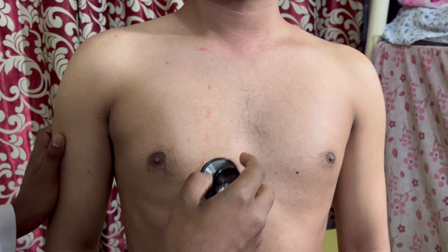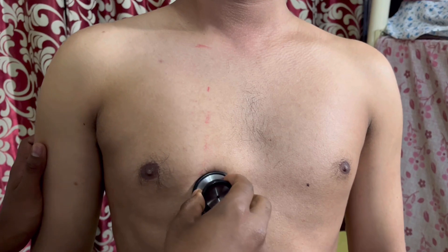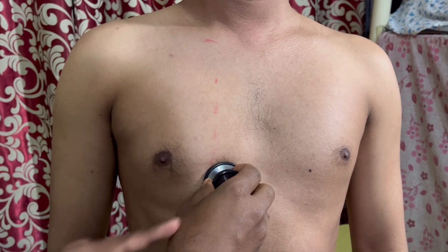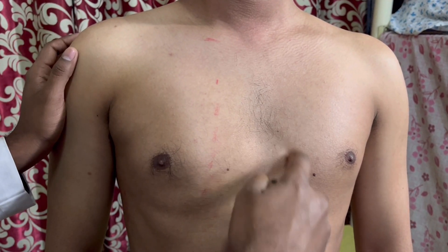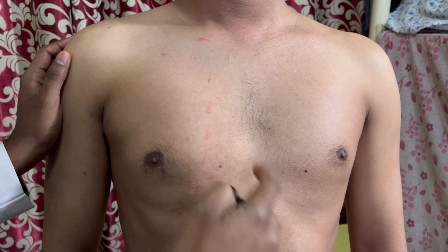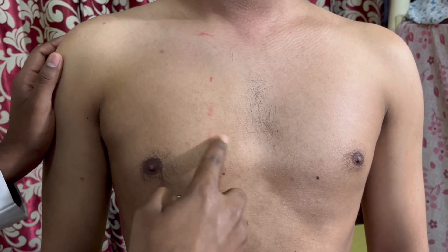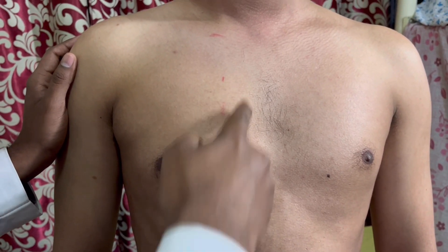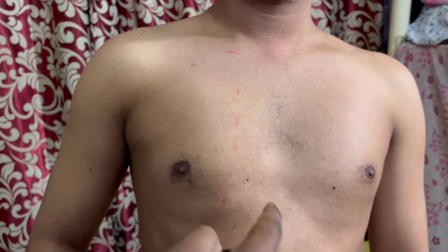Then we auscultate the fourth and fifth intercostal spaces on the right side only, because on the left side there is the heart. That is why we only auscultate the right side here. After auscultating along the mid-clavicular line, we then ask the patient to fold his hands and place them on his back for auscultation of the axillary line.